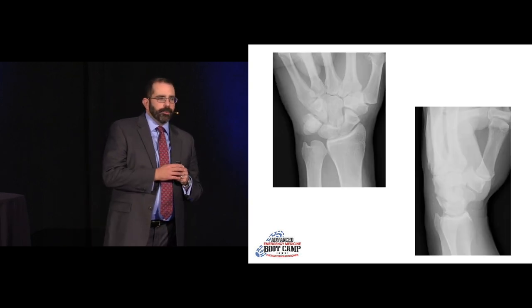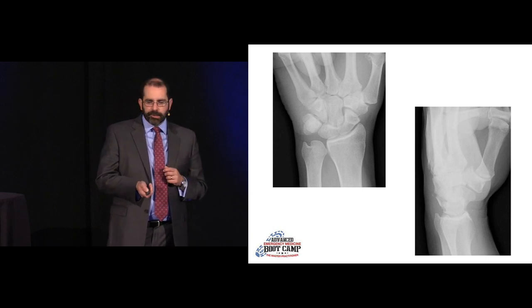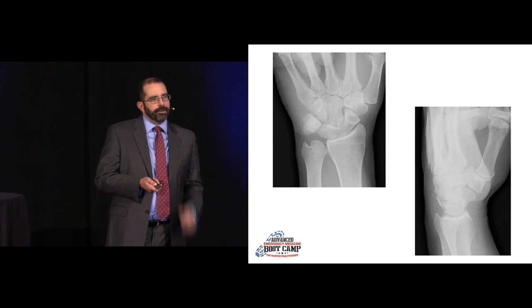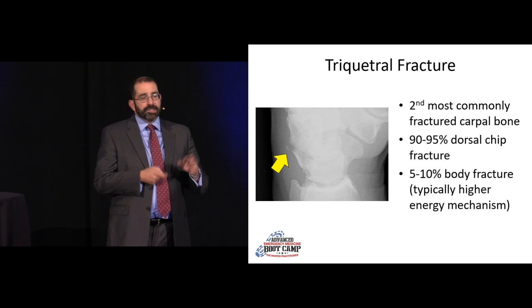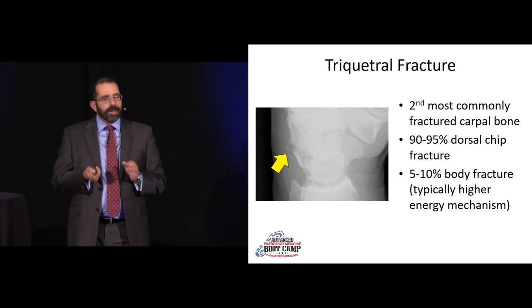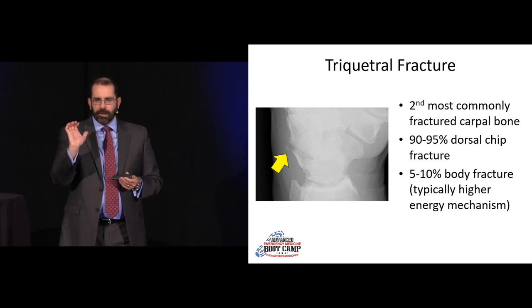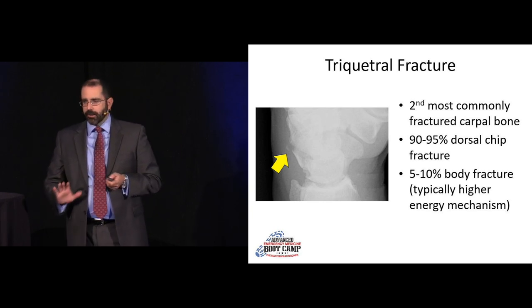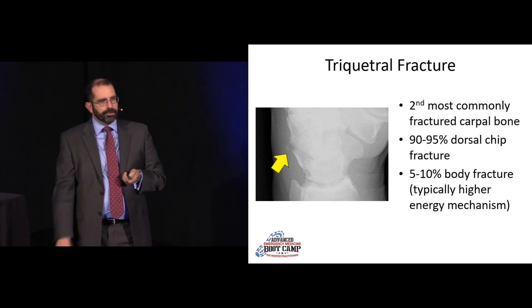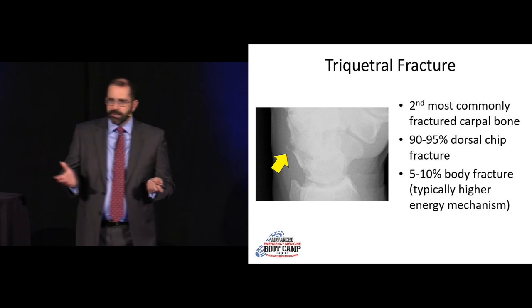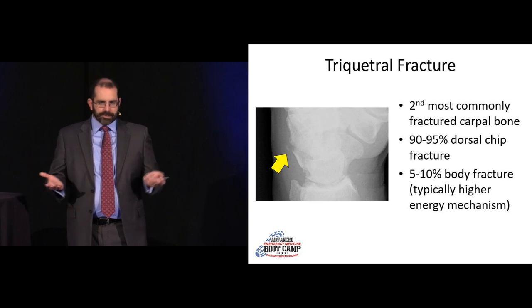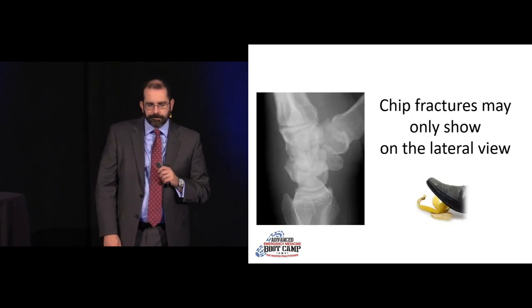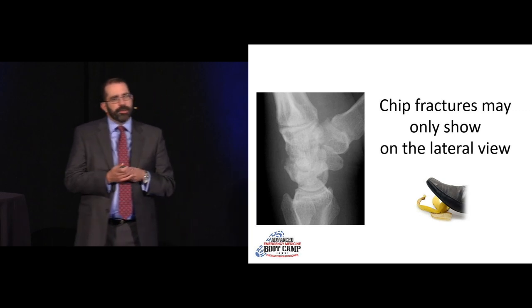Another FOOSH with wrist pain: the AP film looks pretty good, nothing obvious, but on the lateral we see a little fleck — that's a classic triquetral fracture. It's a tiny little chip fracture, most commonly from a FOOSH. It's the second most commonly fractured carpal bone. The vast majority — 90 to 95% — are these dorsal chip fractures, likely from the ulnar styloid chipping off that piece during hyperextension. The remaining 5 to 10% are body fractures, which tend to be higher energy with associated injuries.